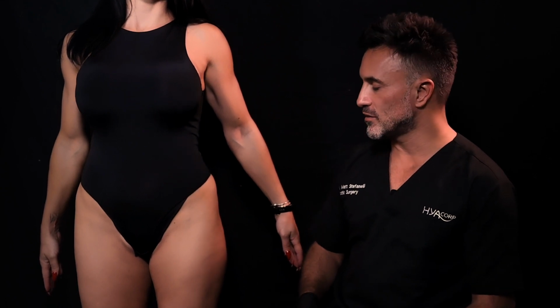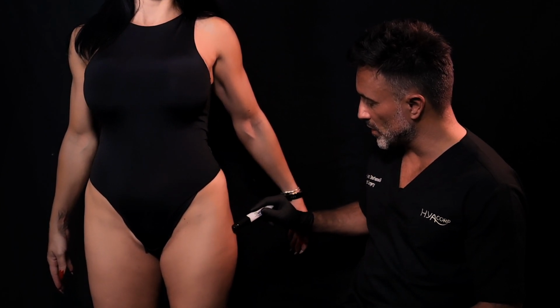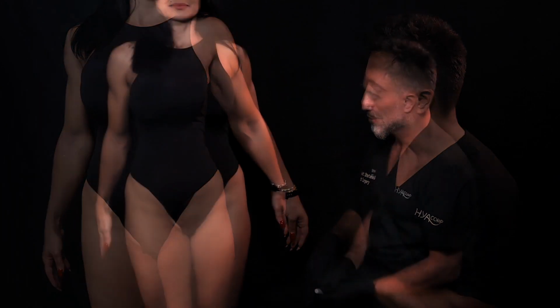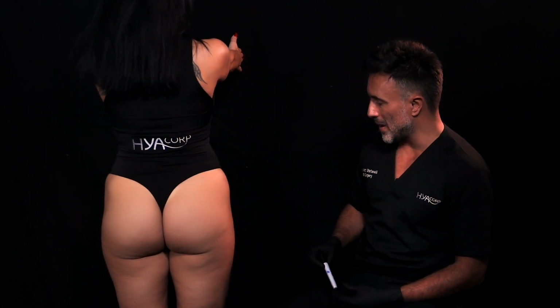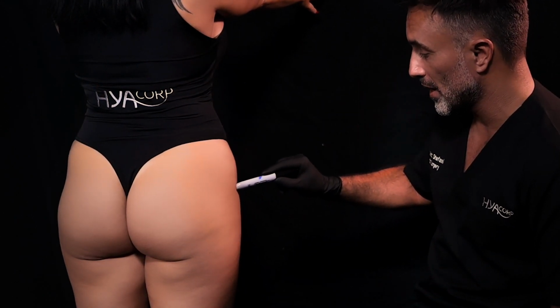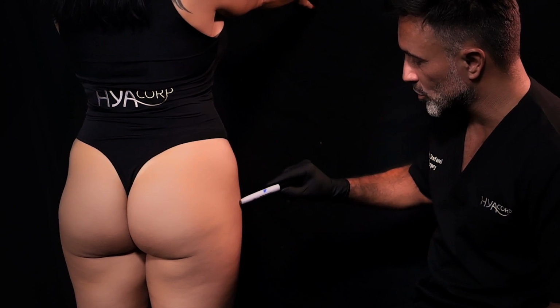So you can appreciate on this frontal view the three levels of the hips: upper, central and lower, and the hip dips really correspond to this central zone and also to the great trochanter. So now I'd like Marie to turn 180 degrees, and we can appreciate now these hip dips from the back view. Again here the upper hip, the central hip or hip dips, and here the lower hip. So we are going to focus our treatment in this central hip or hip dips or hip depression.